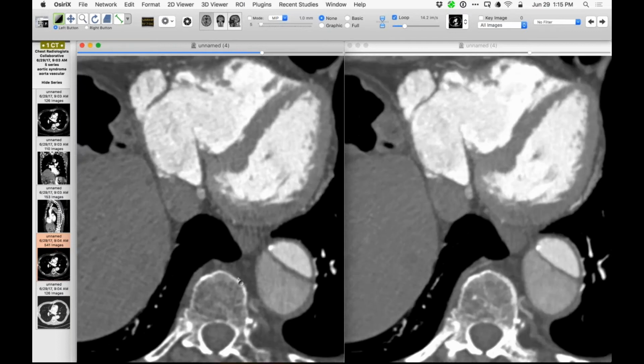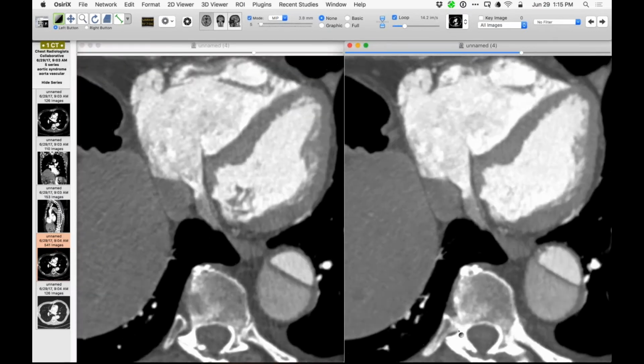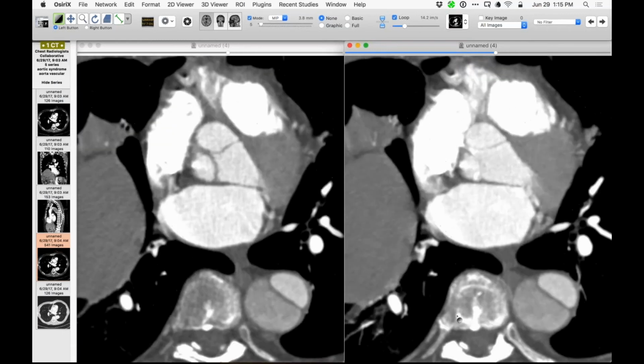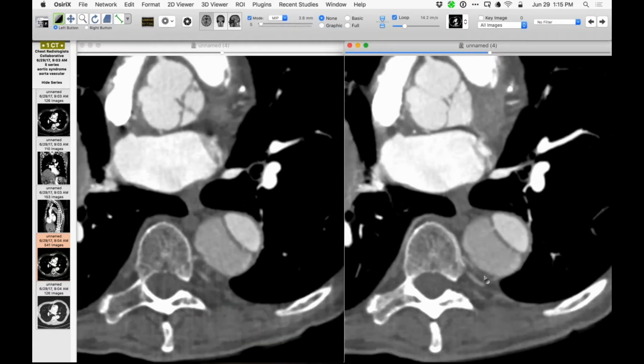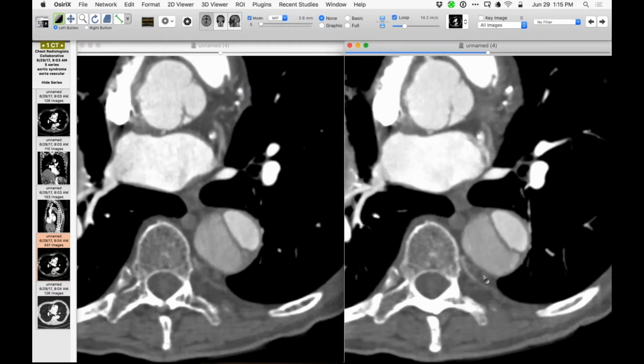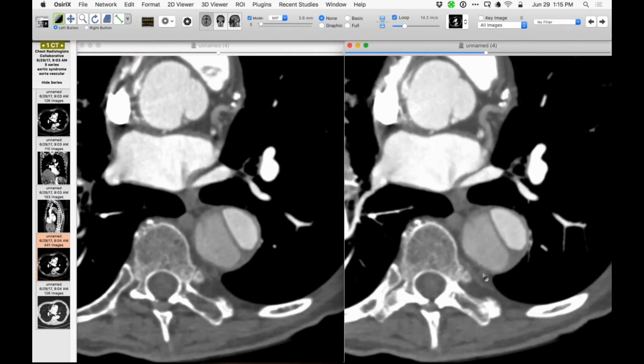Absolutely. Yes. And the more you see. The surgeons will say, at least with IVUS, that they see a lot. And I think that sometimes explains why endovascular stents succeed in some cases for type B dissections and fail in other cases, if there are a lot of fenestrations versus just one large proximal fenestration.